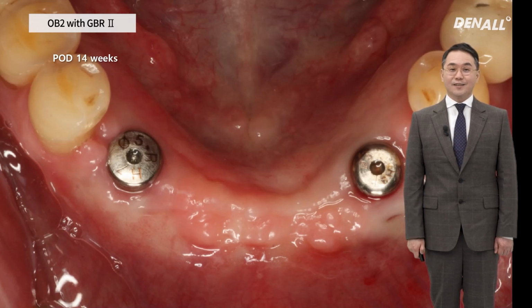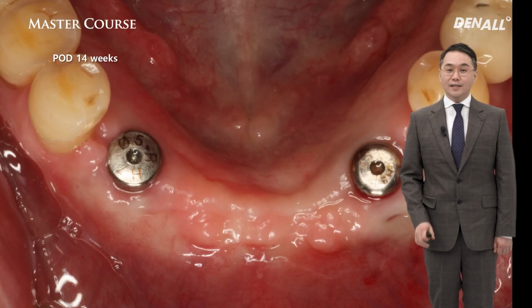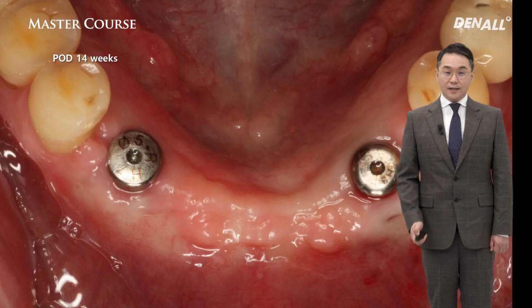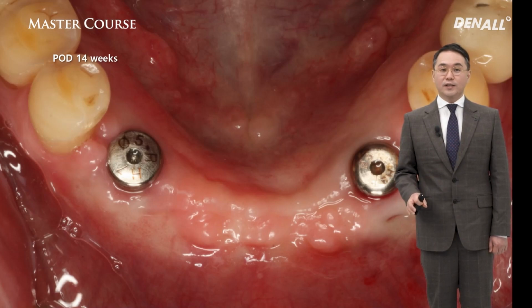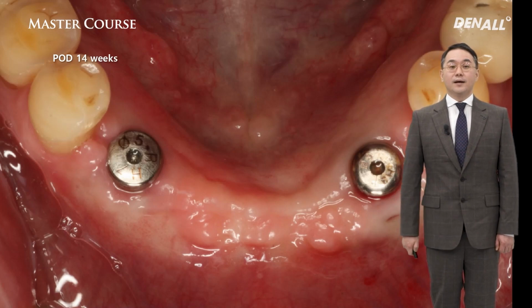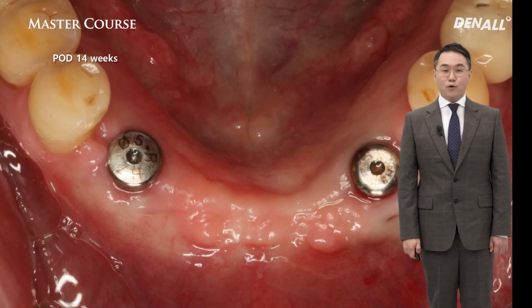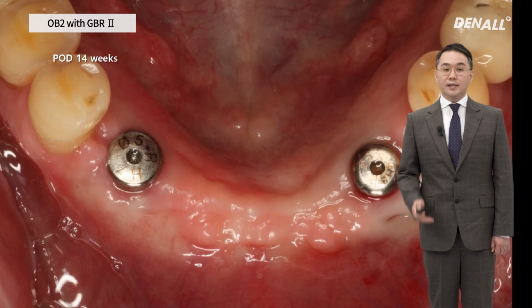However, on the left side, I needed to remove the Ossbuilder, so I slightly opened the flap. If I had used conventional titanium mesh, I would have had to open flap extensively because I had to use bone screw or bone tack to fixate the titanium mesh, which I would have to later remove. However, in the case of Ossbuilder, when you remove it, you don't have to open flap extensively because Ossbuilder is fixated just with healing cap.